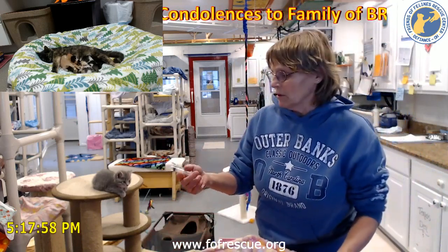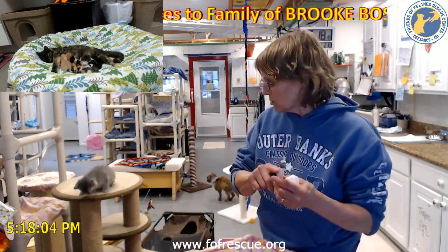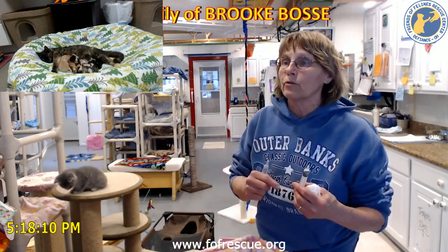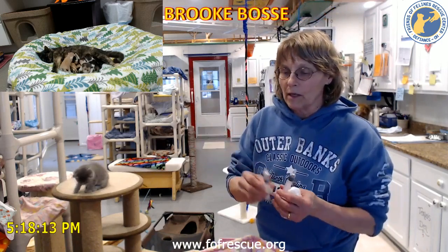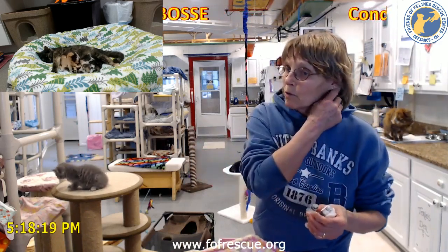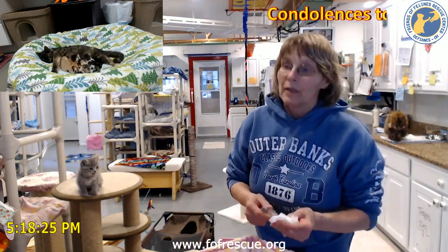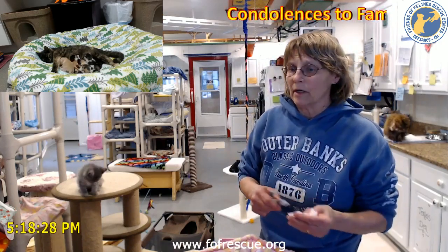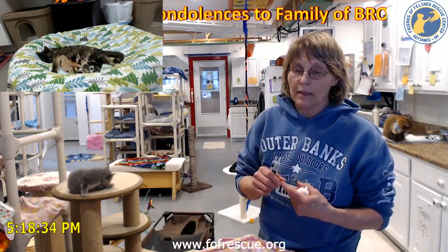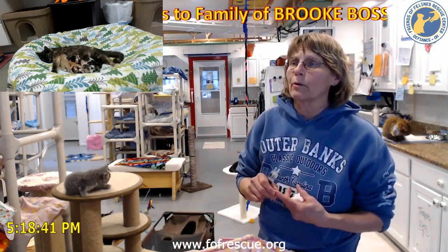One before and one after, because you always want to make sure the tube is clear before you feed. It's not got any gunk in it. It shouldn't. And then you feed, and then you rinse it out with another one. As long as you get at least 3, and this is my second one. I always make sure I give at least 4 or 5 cc's, that way she has enough fluid. So as long as we give her one whole can of A&D, which is high calories and high nutrition, that is super duper good nutrition for her for a 24-hour period.